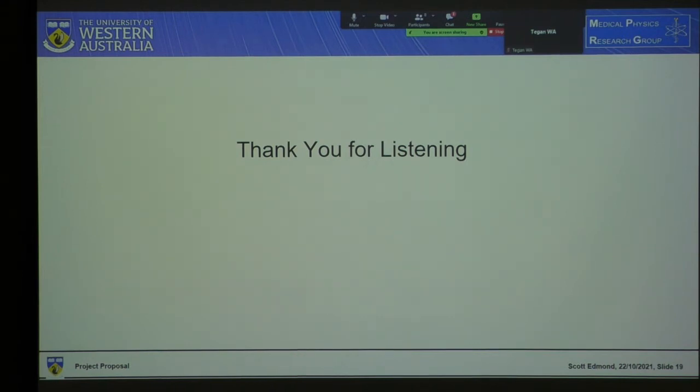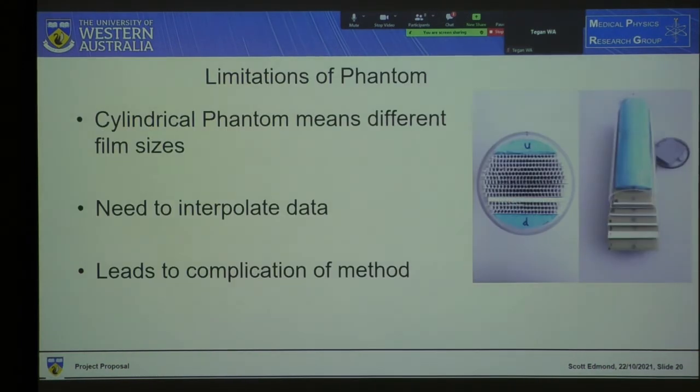I was just wondering, so you're going to have sequential pieces of film, right? But you're planning to create a fully 3-dimensional representation of the dose. So there's going to have to be some interpolation. There is interpolation. I think I got a slide for it here. We need to interpolate the data between 15 pieces of film.